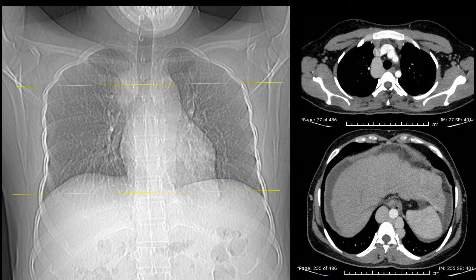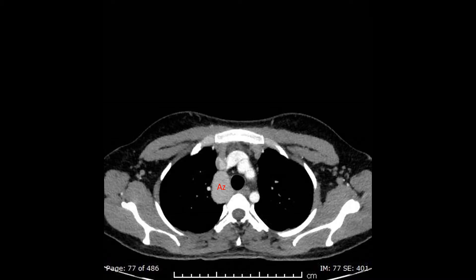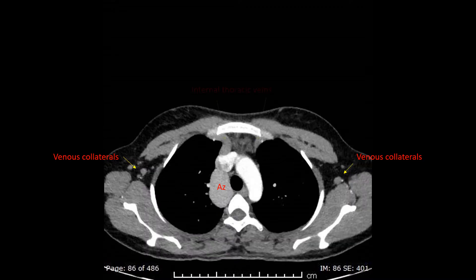This is the opacity of the azygous vein, and this is the site of the opacity which was bigger on the chest x-ray. Let us have a quick look at the collaterals. These are the collateral veins at the axilla and the dilated internal thoracic veins.